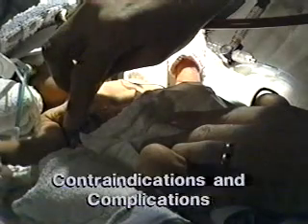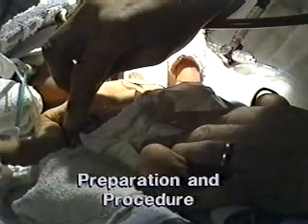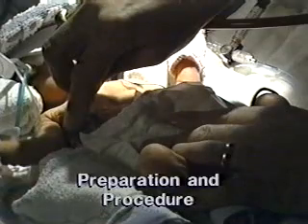In this video, we will look at some common reasons for the lumbar puncture procedure, contraindications, and possible complications, and will demonstrate how to prepare for and perform a successful procedure on a term and a premature infant.